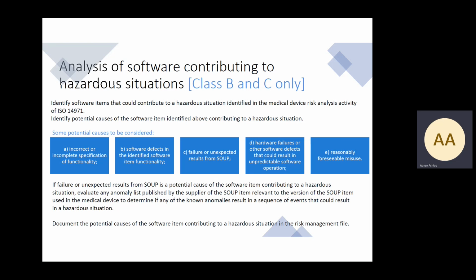I see that as an imperative task, that the sequence of events is outlined in any risk management process, regardless of software, so that you can carefully analyze and evaluate what could be the potential risks by the user or users and possible foreseeable misuse.